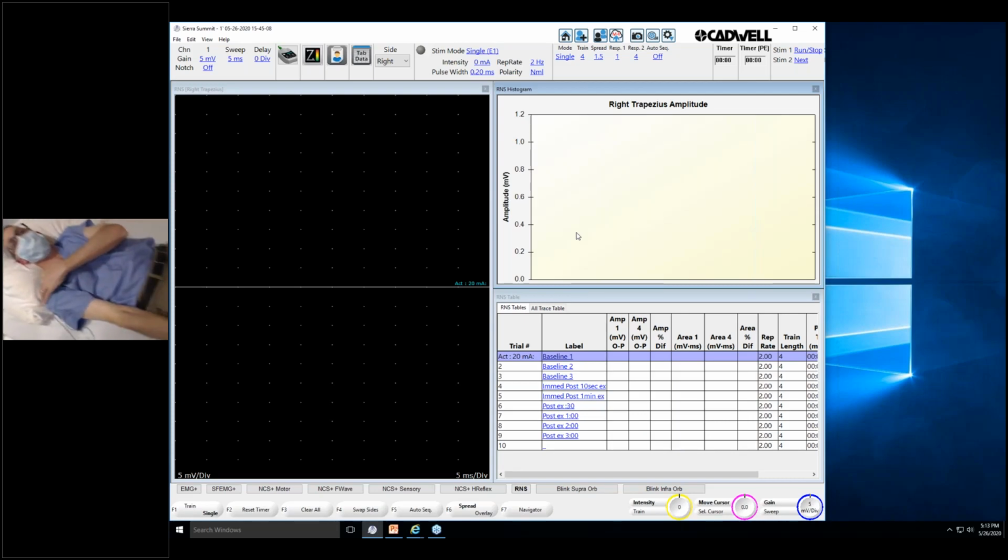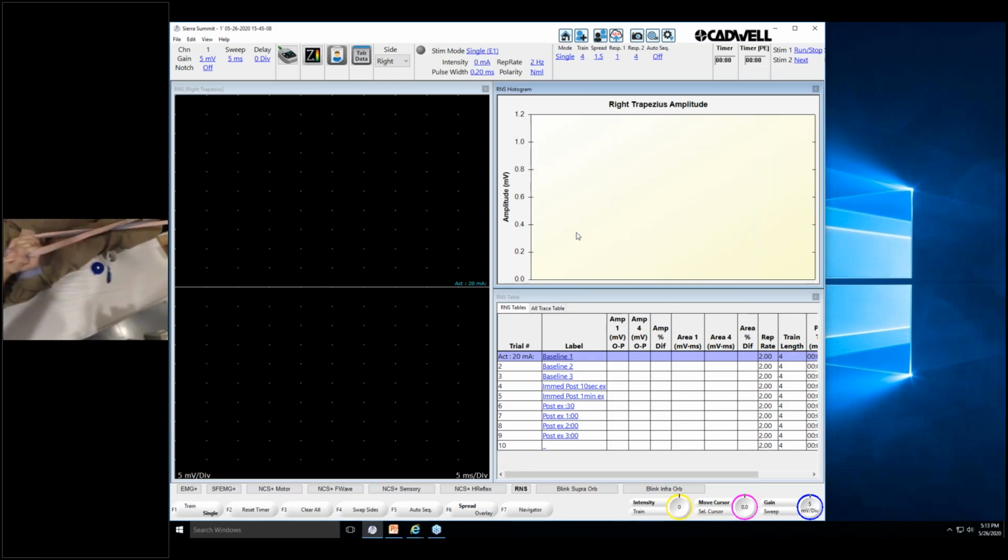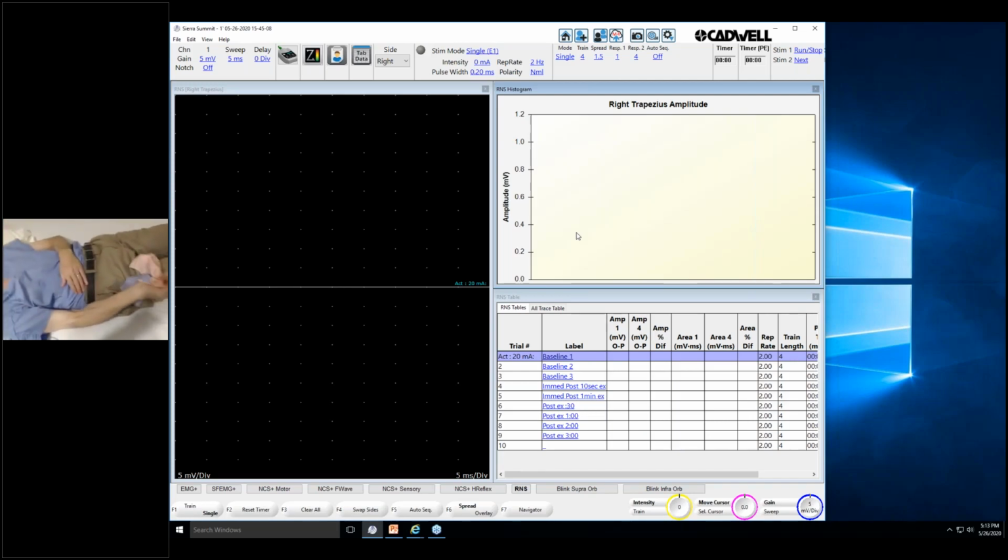That still won't keep the muscle perfectly stable. It's still going to move when she stimulates. So that's where it's really important to hold the stimulator as steady as possible. But this is a way that'll allow me to exercise that muscle. If you use these bands, and you can even use a sheet and tie it in a circle, you want to make sure the patient's not flexing their elbow. They want to be contracting the trapezius. So you have to instruct the patient: don't bend your elbow, but shrug your shoulder to exercise.